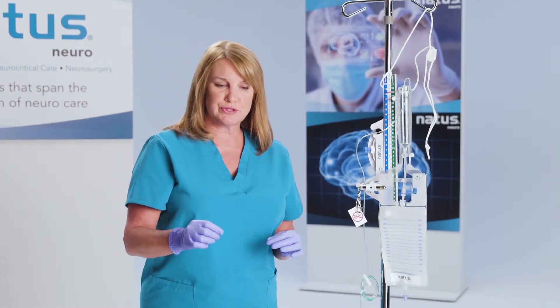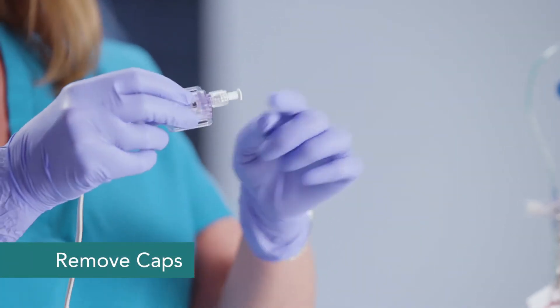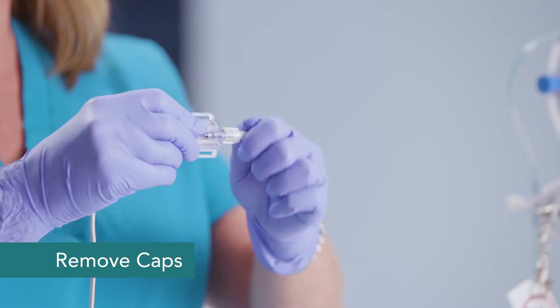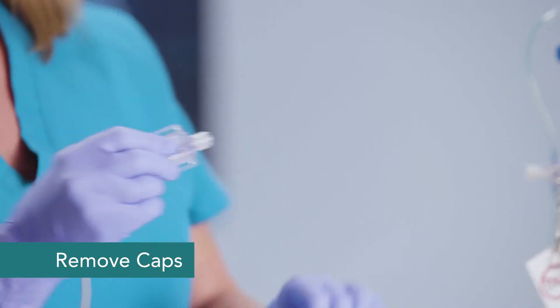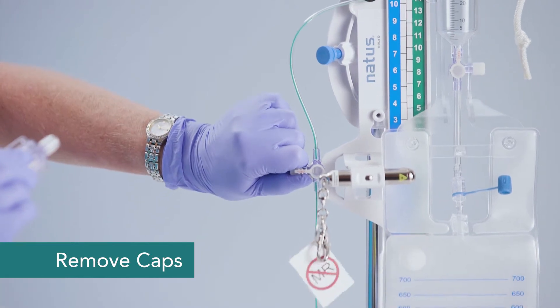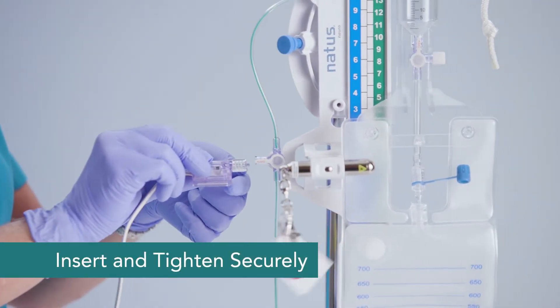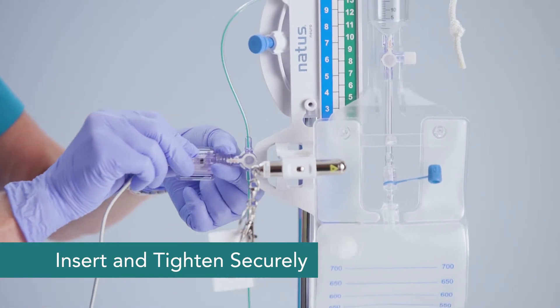To add your external transducer, you'll want to remove the cap that's going to attach to your system stopcock, and make sure that you insert this and tighten it securely.